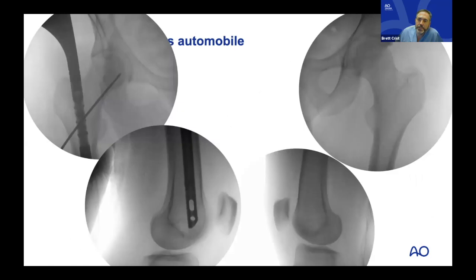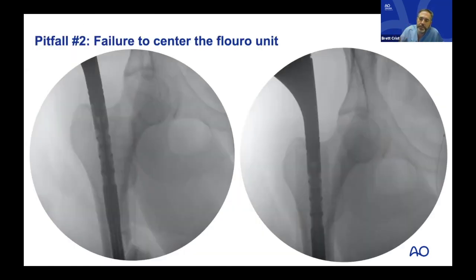And also make sure that you have the tilt of the C-arm or fluoroscope in the same plane as the bone that you're imaging, because that can also cause projection issues, like what you're talking about. Yeah. So if you put them on a big bump, they're rotated up, and it's going to be closer to the beam, and so that may cause a difference in length measurements.